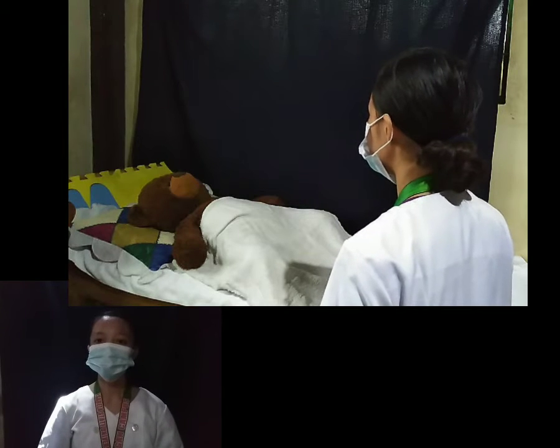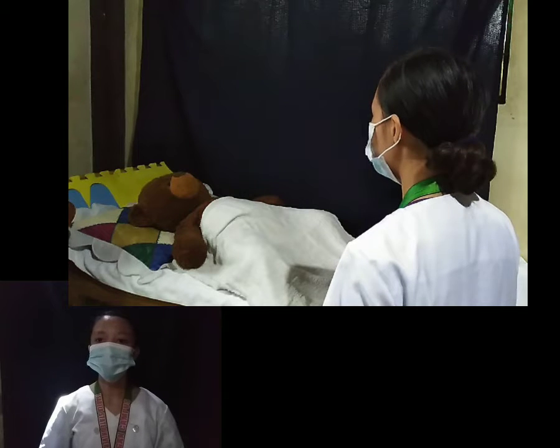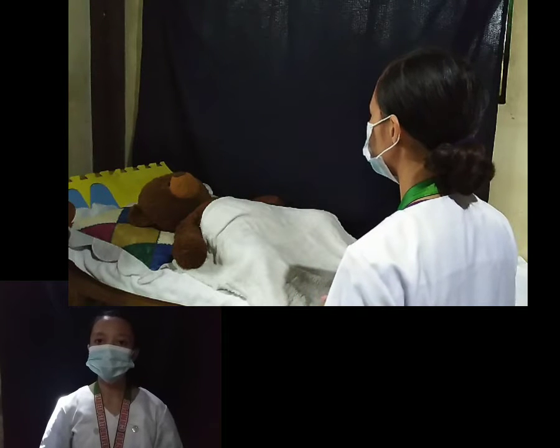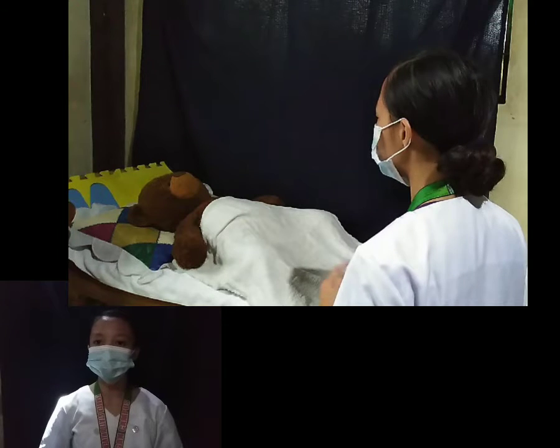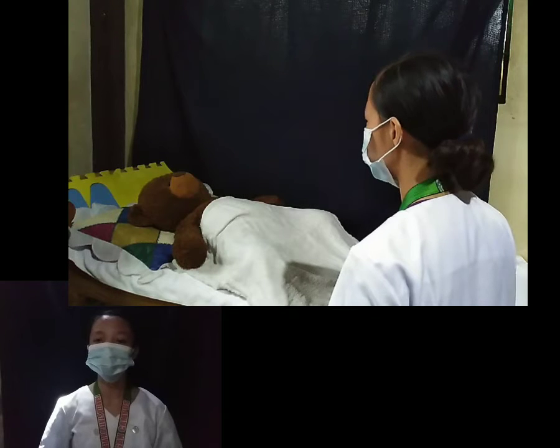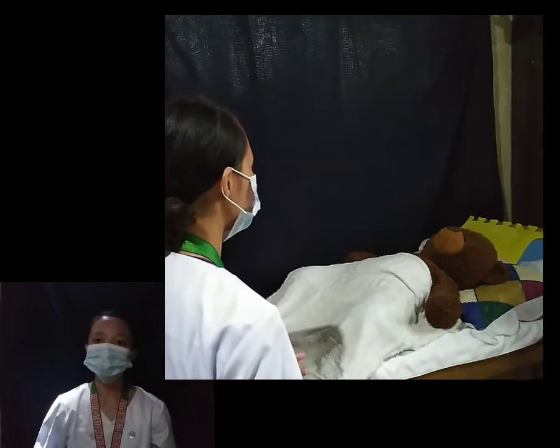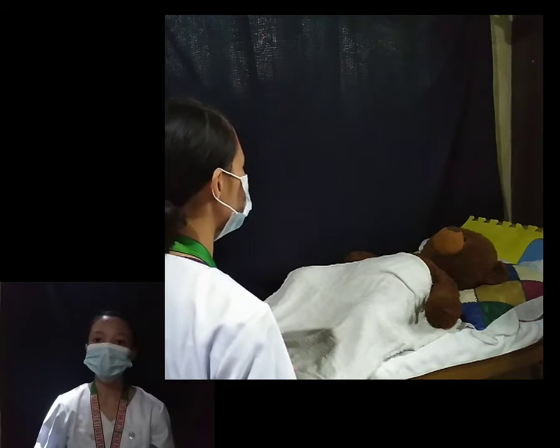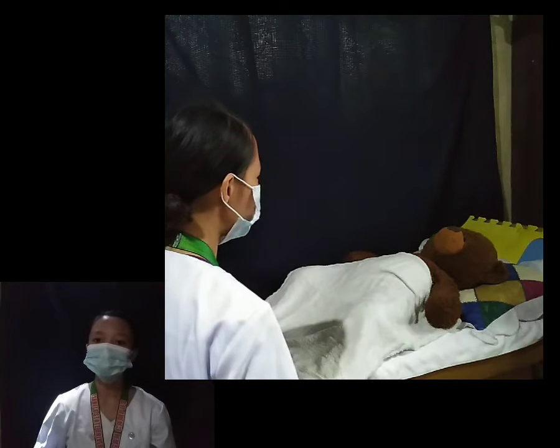So after introducing yourself to the client and identifying your patient's identity by letting them state their name, explain to them the procedure and why it is necessary for them to cooperate, because the physician may have ordered catheterization because the patient's bladder is distended or there's a need to obtain a urine specimen. Then of course, we should tell our patient honestly that during this procedure, it might be painful but it is tolerable. Then drape them properly by exposing only the female genitalia.